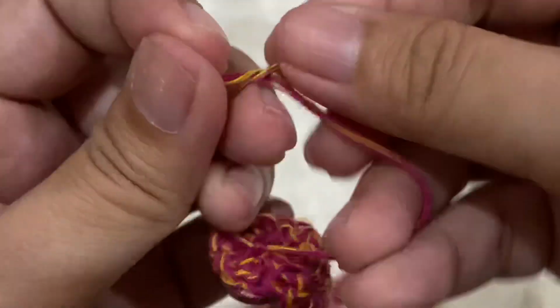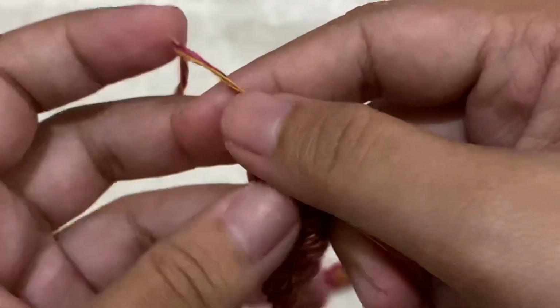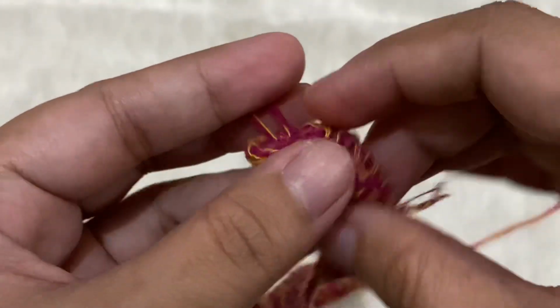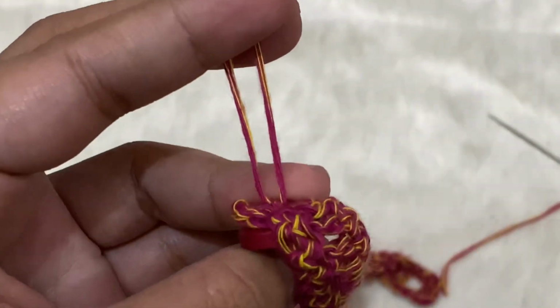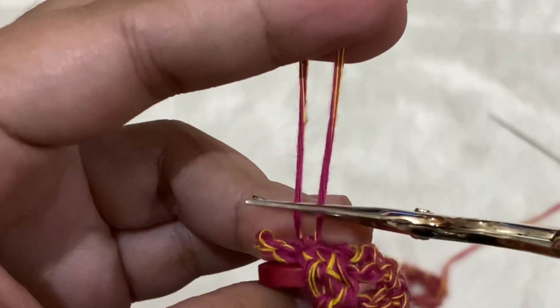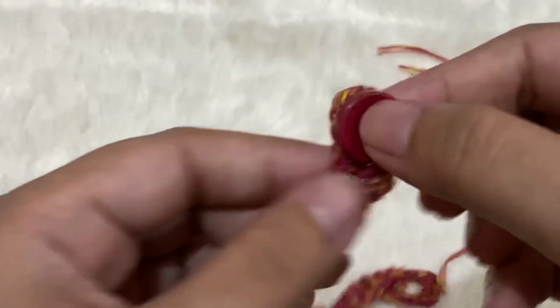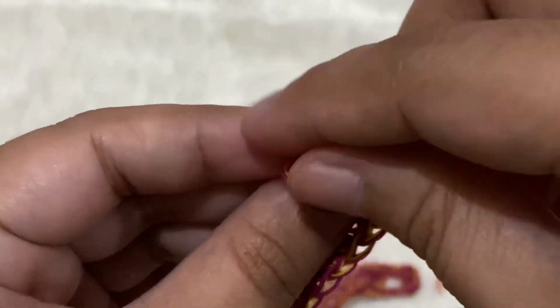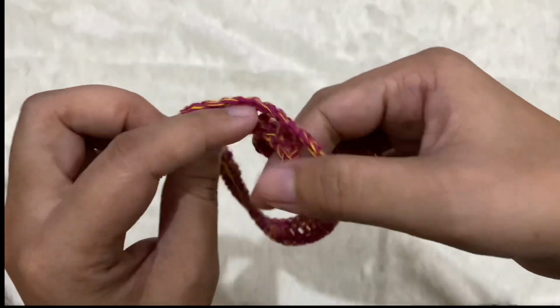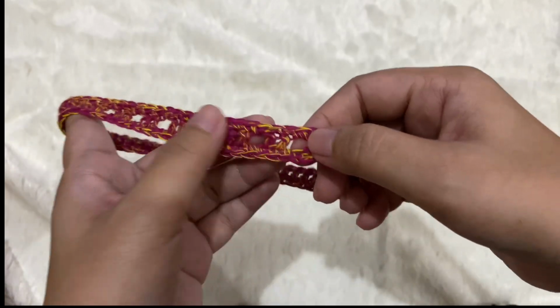So right there, it's actually already secure, but if you want to tie another knot, that's fine. I actually tried to unravel this and it's really hard. I did not succeed, so I think that's secure enough. And then cut off the tails and you should be done. Okay, right there. And your ear saver is finished.